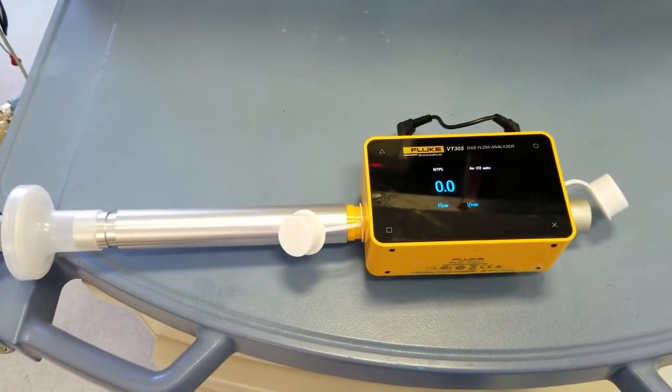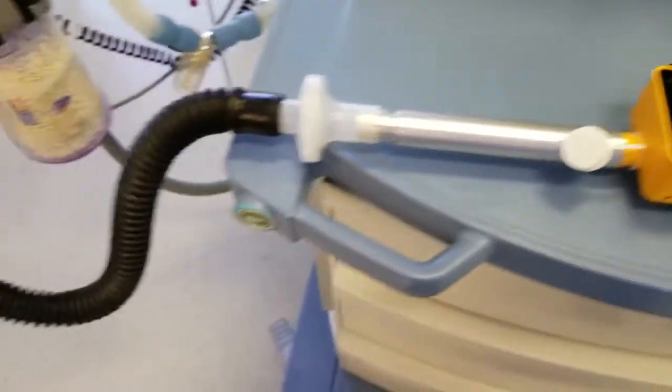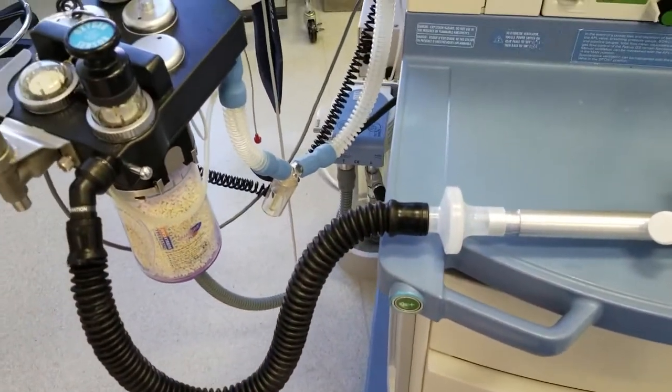We're back with the VT305, and we're going to do a flow test with it. I'm going to test the oxygen output with the Draeger Fabius GS.